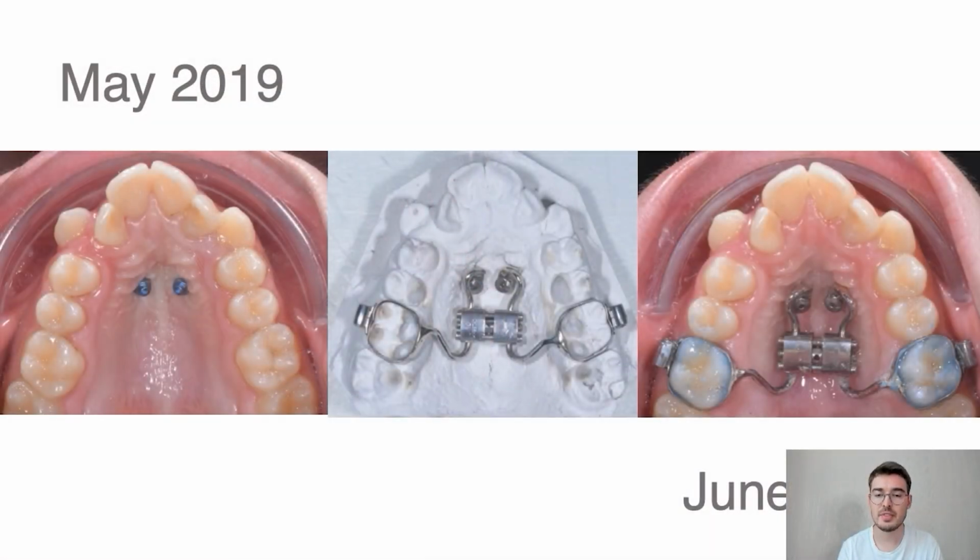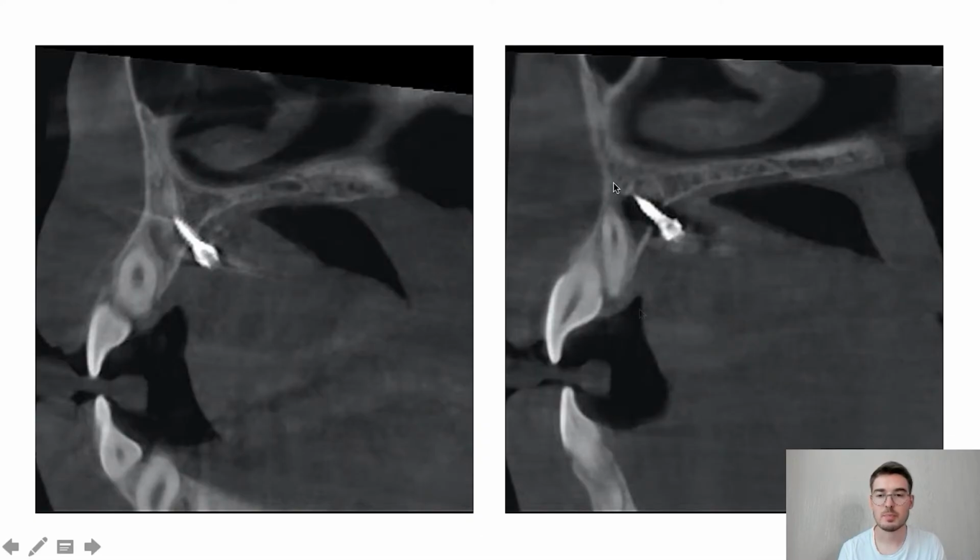That is why the force that the screw will create when activated should last for as long as possible, and such positioning of the beams can deform them, so the screw may not apply all its strength to the bone. If we had installed beams from the palate area, the structure would have been more solid, unified and rigid, and it is extremely important. In this case, the microimplant was positioned at a certain angle, monocortically.